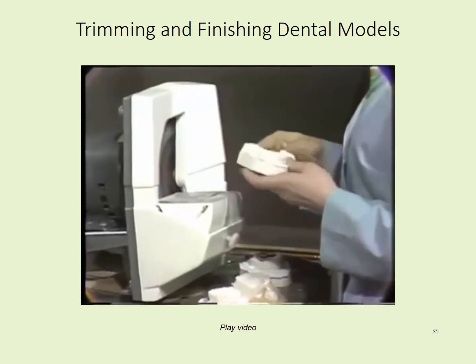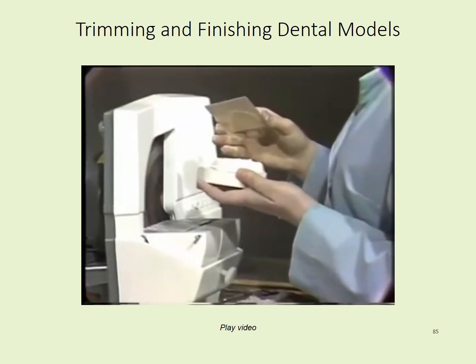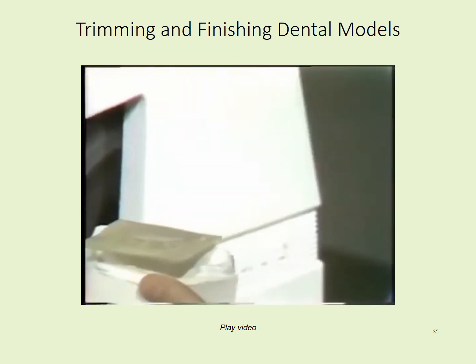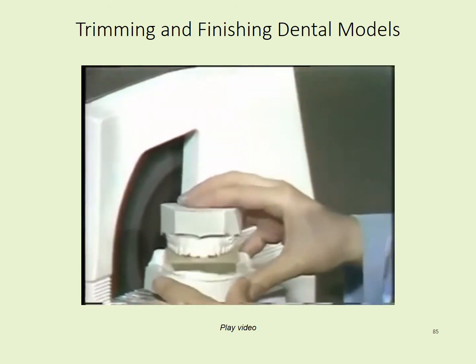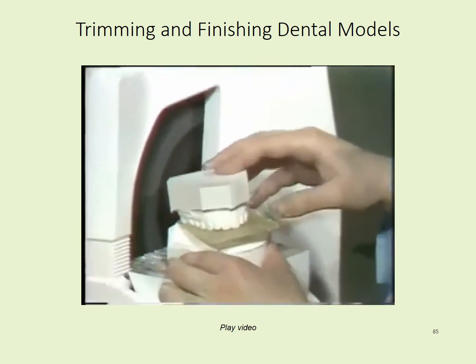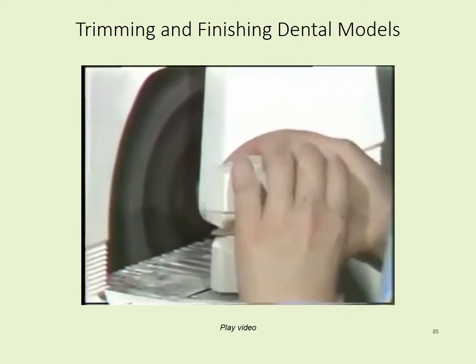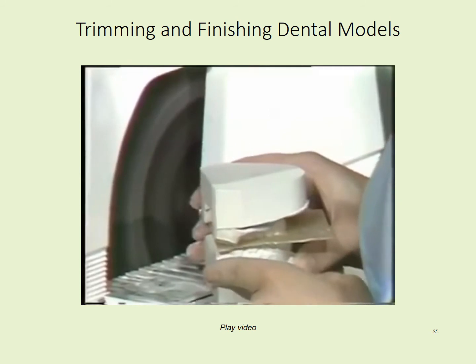To trim the lower cast, you should relate the upper and lower cast together. A wax bite is very helpful in doing this. The first cut on the mandibular cast is to make the back surface parallel and on the same plane to the back surface of the maxillary cast.